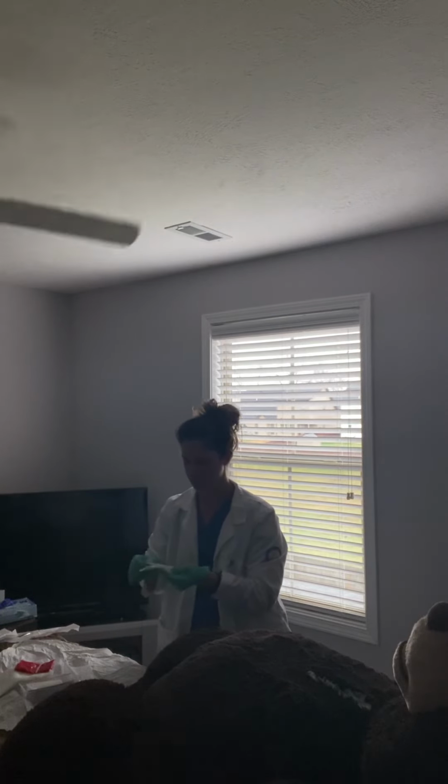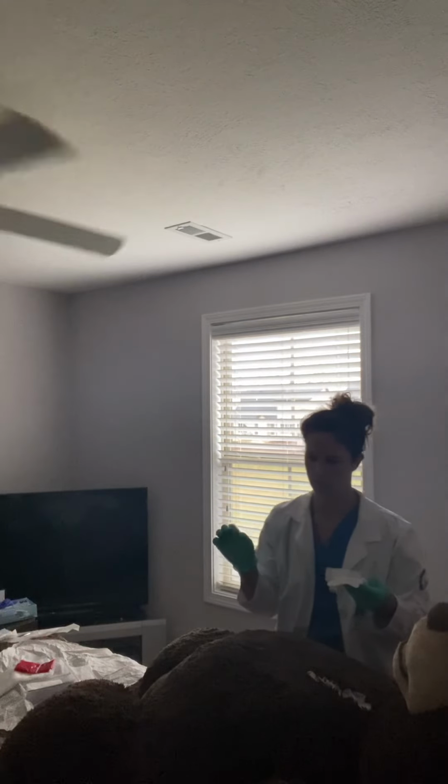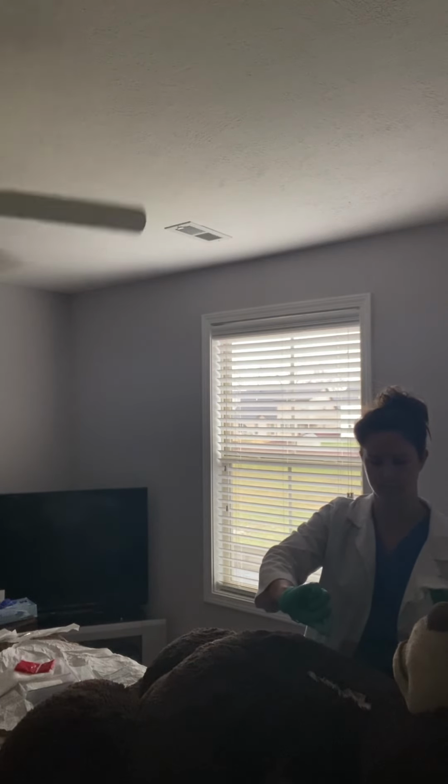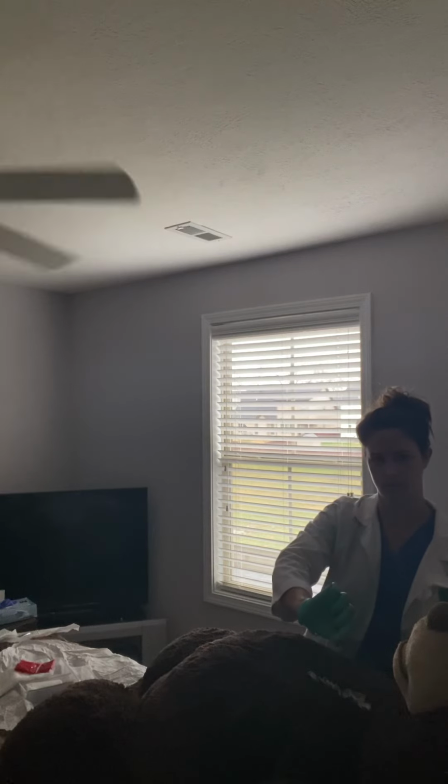I did want to note, when you do assess the wound, and I'm pretty sure I said this, that you want to make sure you check for any tunneling around the ridges with your cotton applicator, just running that along the sides, the edges of the wound. If there's any tunneling, you're going to measure that with your applicator as if you were measuring the depth, moving your finger to the edge of the wound and then measuring that on your measuring tool. And for documentation, you would put that as, say there was a tunnel at 3 o'clock, you go 3 o'clock, tunnel 3 o'clock, and then 2 centimeters.